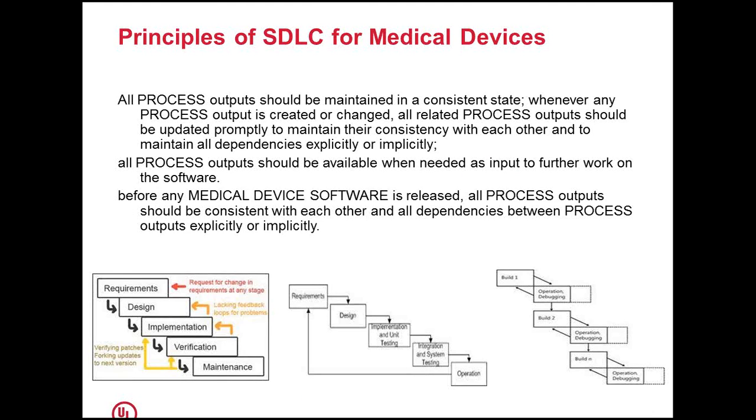Irrespective of the model used for development, there are certain principles to be followed for medical devices. The standard clearly specifies that all the outputs should be maintained in a consistent state. That is, whenever any process output is created or changed, all related outputs should be updated promptly to maintain their consistency with each other and to maintain all dependencies, explicitly or implicitly.